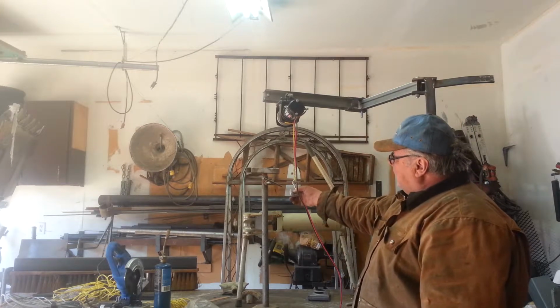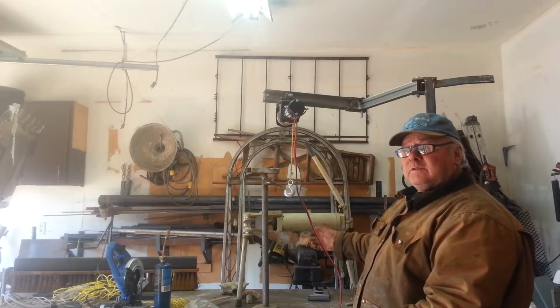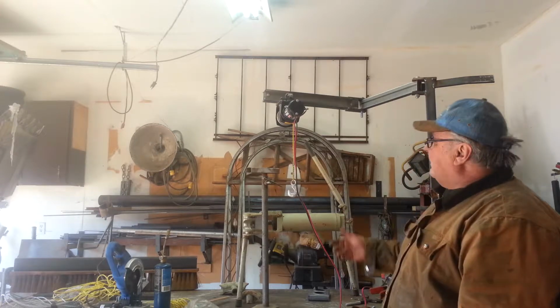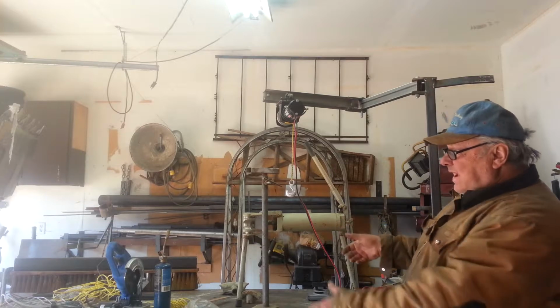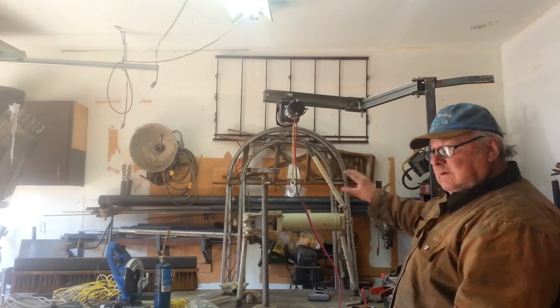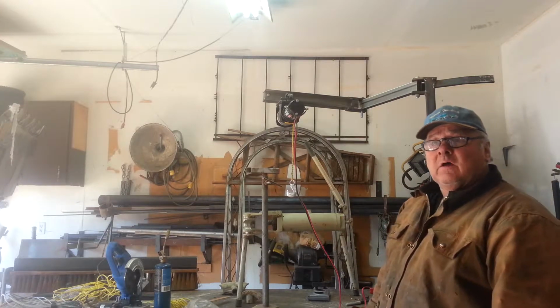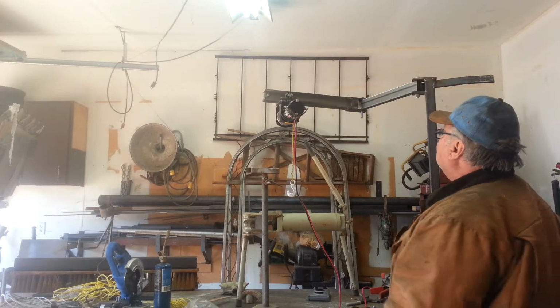I will have a sling that goes from the hooks somewhere that'll just hook onto the frame to its center point, so it's easy to balance for her. If I don't have quite enough lift to get it in the van, she can at least pull the wheelchair down to get 2 wheels in, and again it'll slide in. She won't have to do any lifting. Before, she had a little ramp that she made. She had to try and pick it up, and it is heavy.